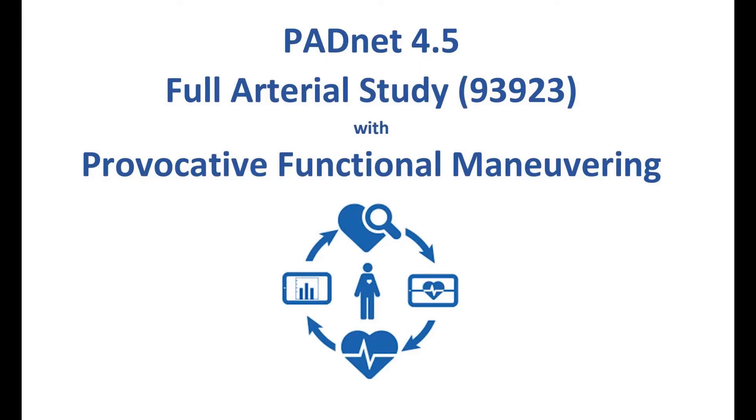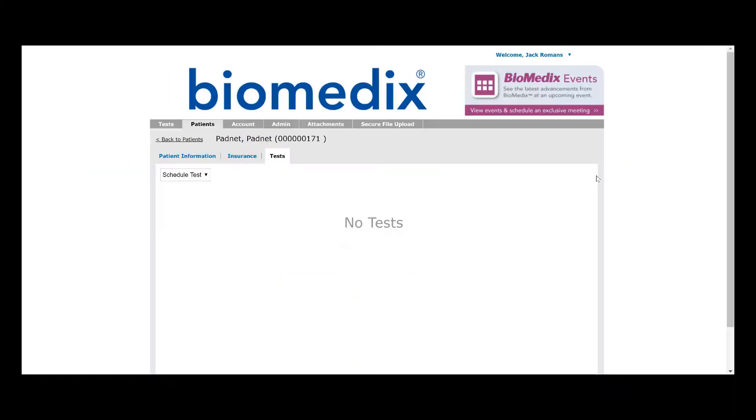In this video, we're going to show you how to schedule a patient and conduct a full arterial study using the provocative functional maneuvering, or the heel raises.